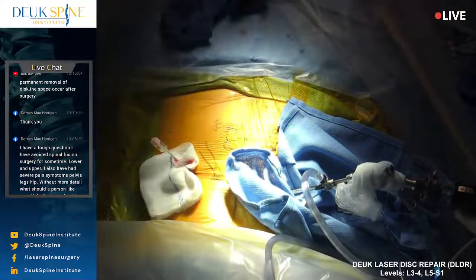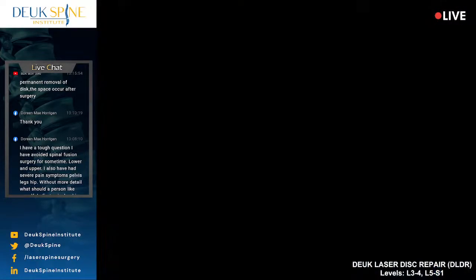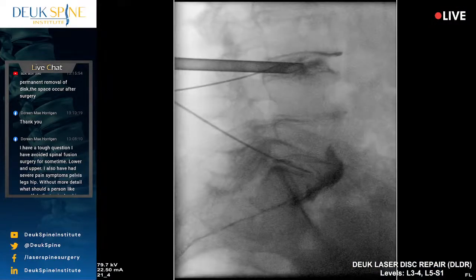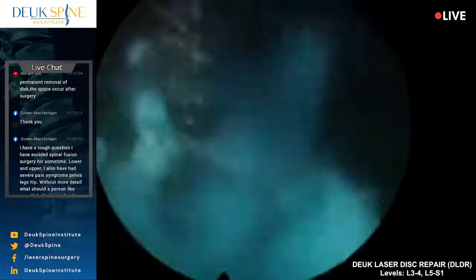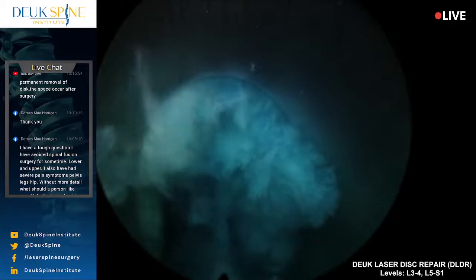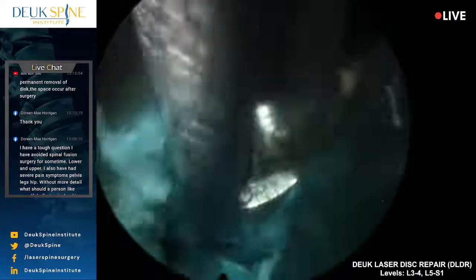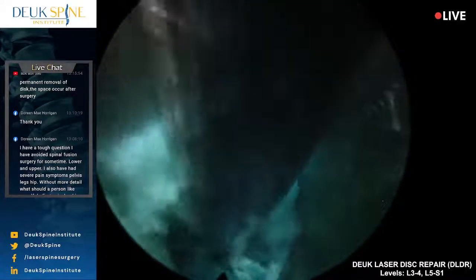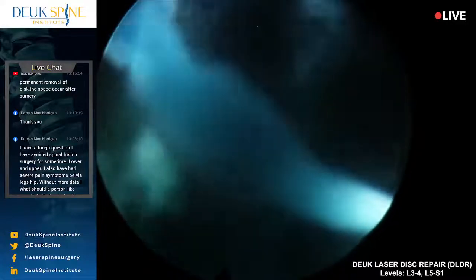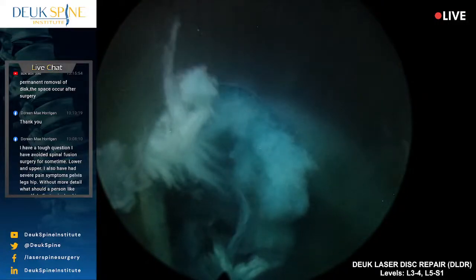All right. I need to see up there. So we are now inside the L3-4 disc, and that's what you're seeing. And that's not a normal disc right there. It looks like crab meat, and crab meat is how we describe a disc that's injured and has had scarring and inflammation. It looks like crab meat. So I didn't make that up. Other people did.